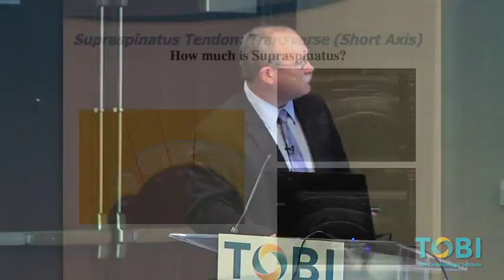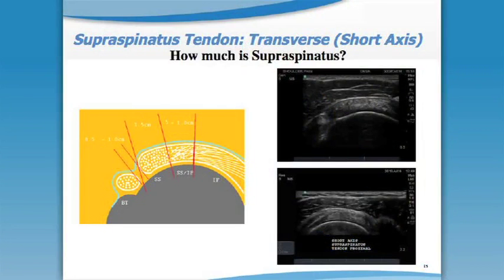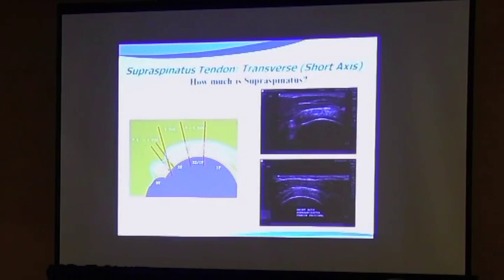The anterior distal portion of the supraspinatus is right up against the biceps tendon. I'm often asked, where does the supraspinatus end and the infraspinatus begin? There are a couple of ways to identify that. Up over the humeral head, where you have a more dome shape appearance to the bony surface, and you'll recognize the articular cartilage, you'll see this oblique line where the supraspinatus fibers override the infraspinatus fibers that are more posterior. That's up over the humeral head.